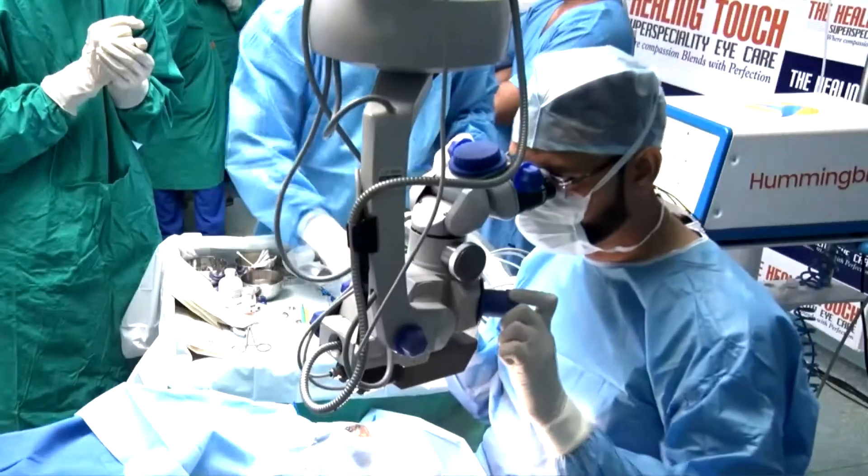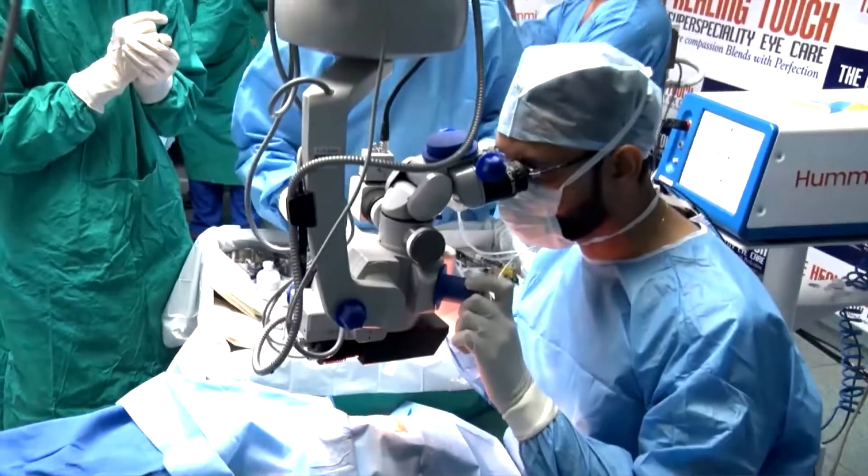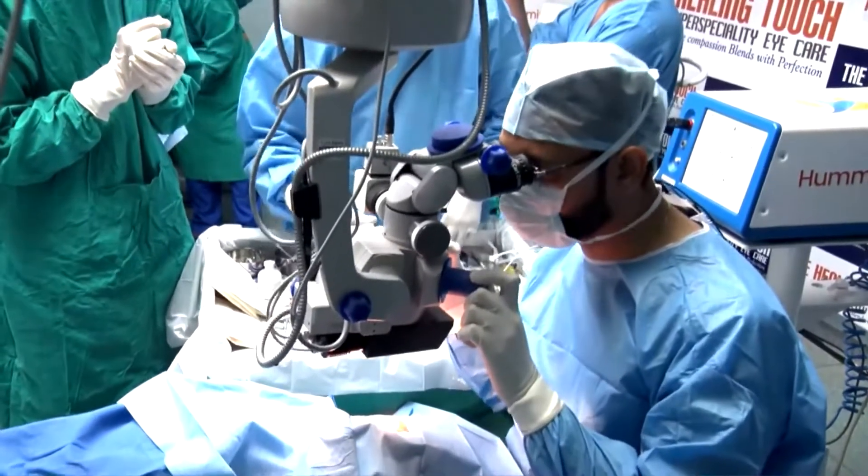This is a double-haptic hydrophobic lens. I don't think any other company is manufacturing this kind of lens. As we are aware of using hydrophobic-hydrophilic double-haptic lenses, this is the first time this company is manufacturing this kind of lens. It has an angulation of around 60 degrees at the optic-haptic junction, which gives excellent stability.